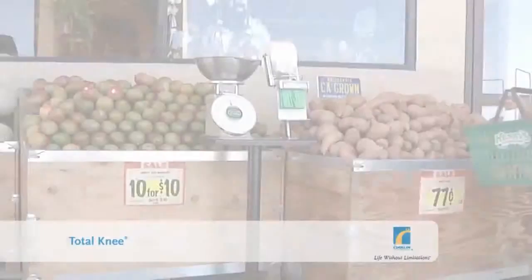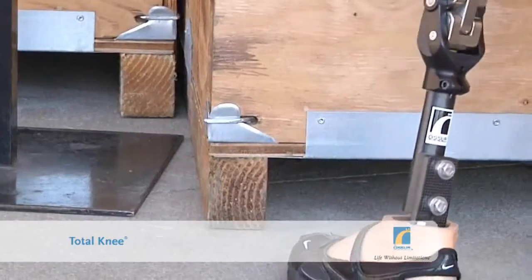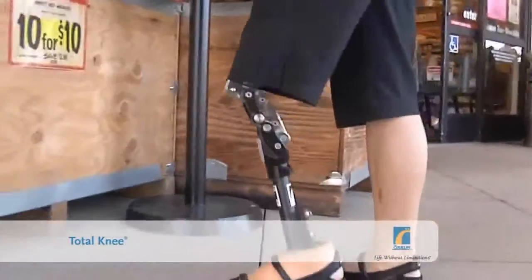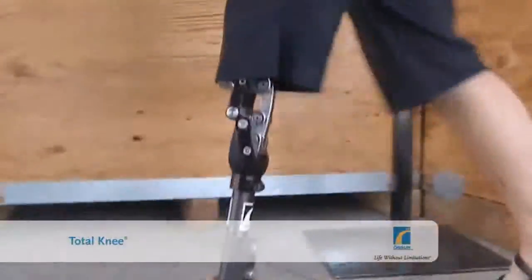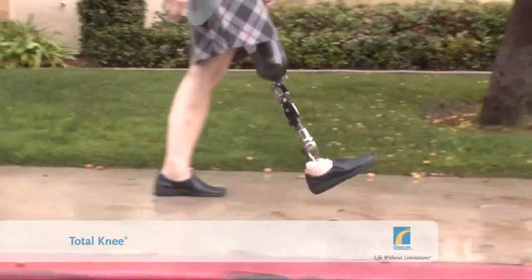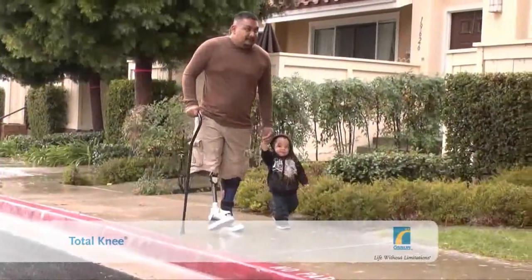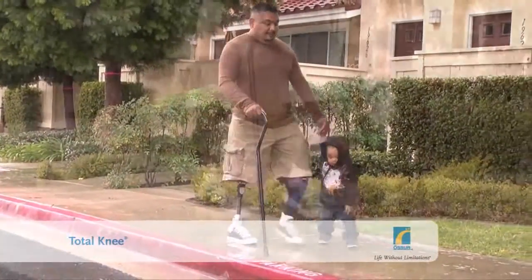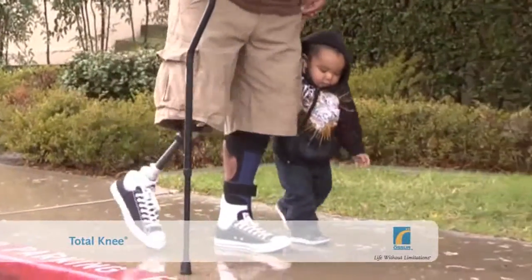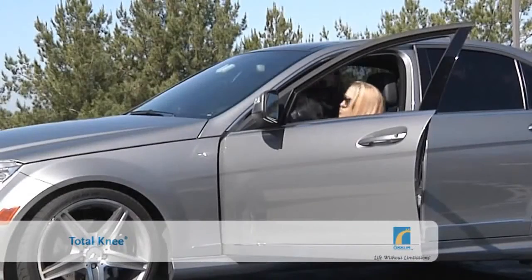So what does all this mean in practice? The locking mechanism provides a high degree of stability, preventing the knee from flexing or collapsing during heel contact, provided that the knee is fully extended. When the knee is locked, you may feel it bending ever so slightly when your weight is on it. This is the shock absorber mimicking the action of the human knee. But don't worry, the geometric lock is still activated and the knee will not collapse.